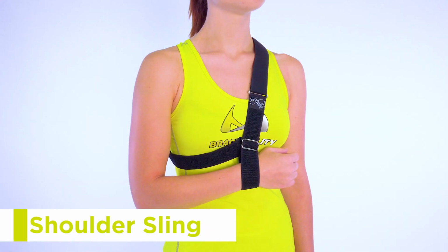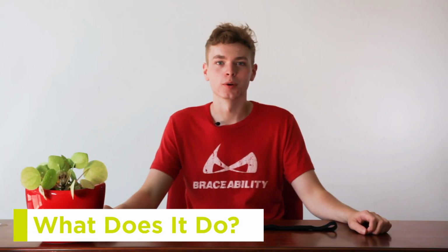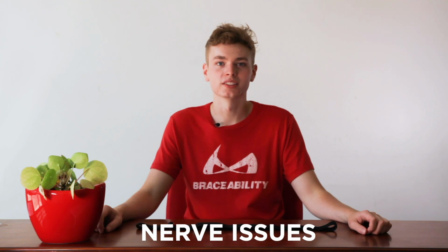Today we're going to be talking about the shoulder sling. This sling is specifically designed to help with a variety of shoulder injuries, including dislocation, subluxation, rotator cuff problems, clavicle or collarbone breaks, and nerve issues. It is ideal for clavicle breaks and nerve issues because it applies pressure to the collarbone and keeps it in place, allowing it to heal with fusion, which results in a much stronger bond.